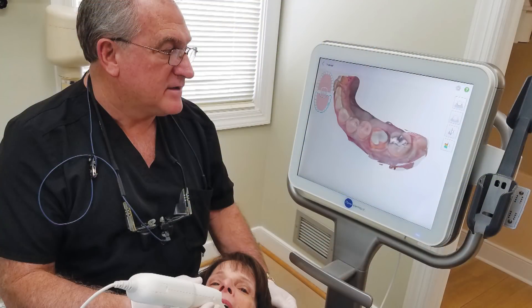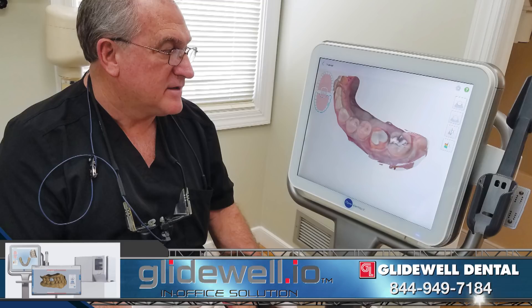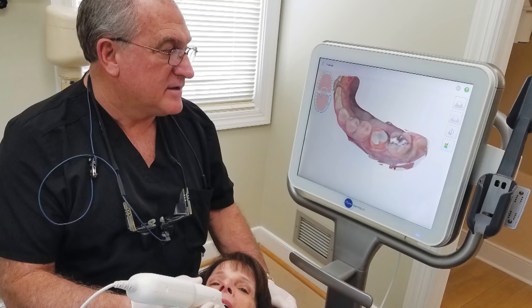The intraoral scanning process for the iTero Element scanner is intuitive and straightforward. I simply scanned the prep, the opposing, and the bite, and completed the digital impression in under a minute.